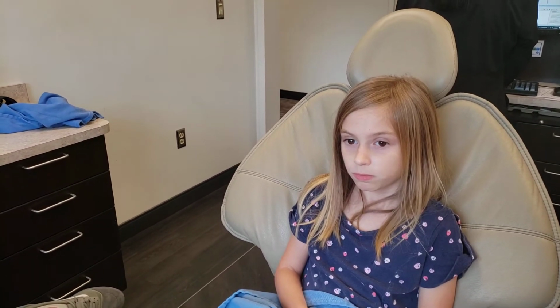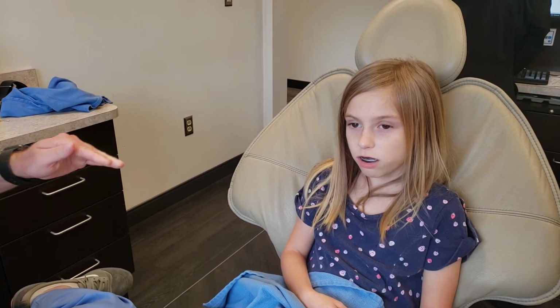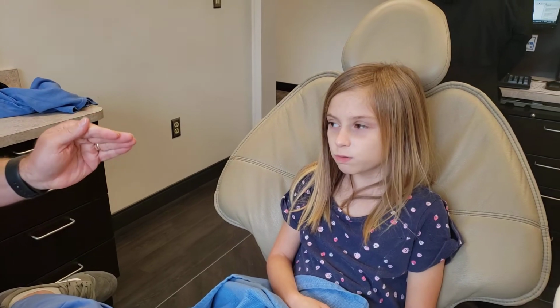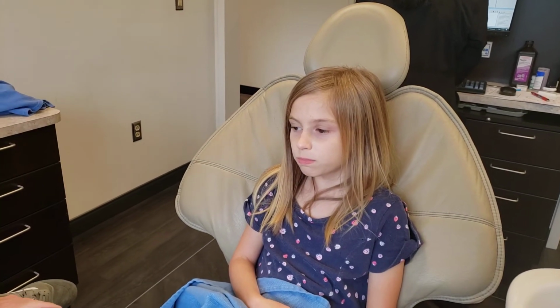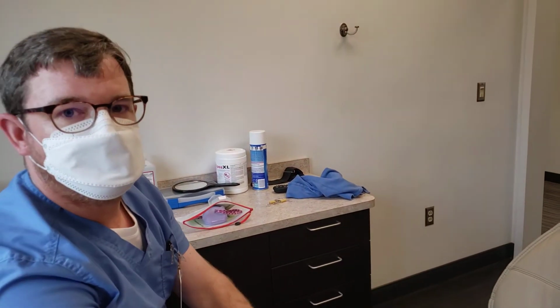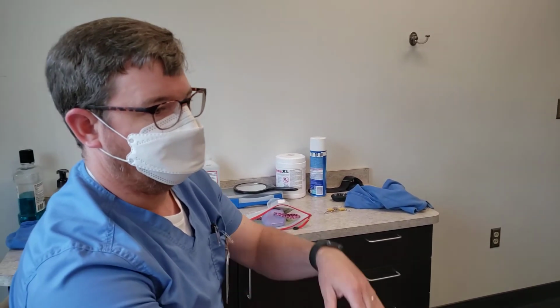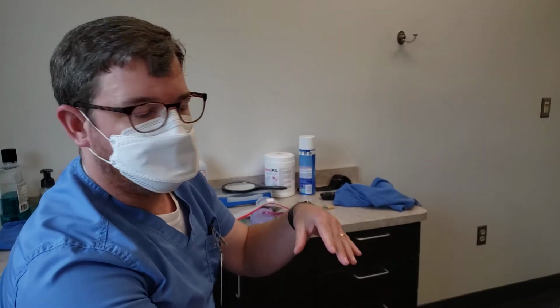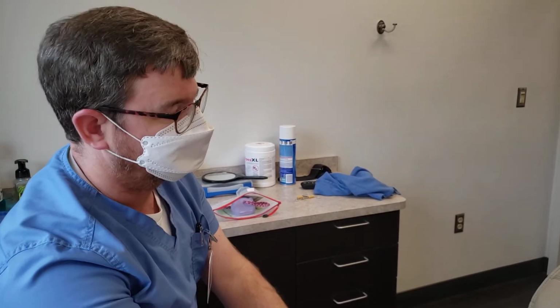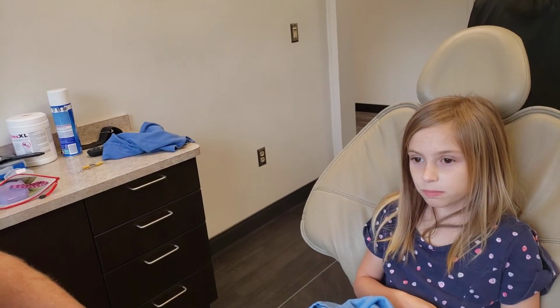And that's where we definitely don't need the habit corrector as much anymore. But we can still use this, and essentially this will act like a retainer after a certain time. They'll wear it a good bit for the first 6 to 9 months, and then we'll get to a stage where they only need to wear it so many hours a week. And then as teeth come out and new ones come in, they may have to wear it a little bit more to catch them.